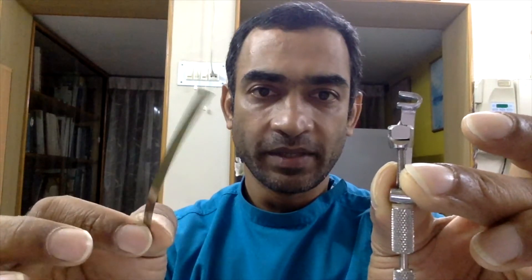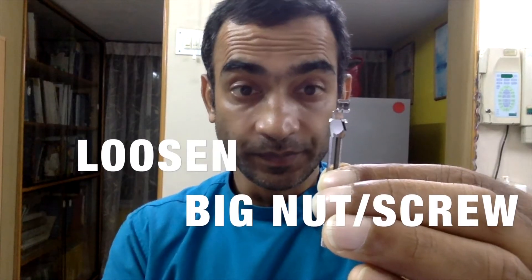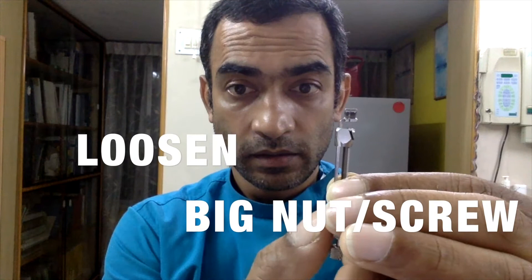The small nut controls the movement of the entire screw length. If you hold the small nut and turn it, you'll find the tip disappears and then reappears. This little nut controls how tight the Tofflemire matrix band is going to sit within your retainer.